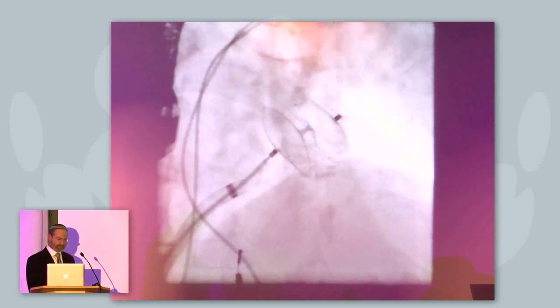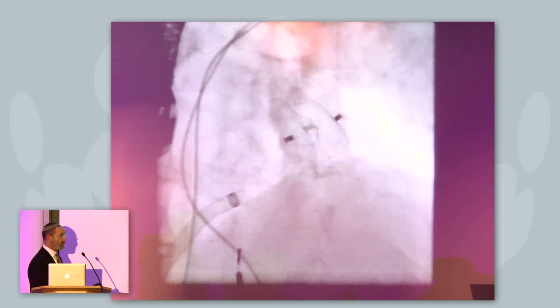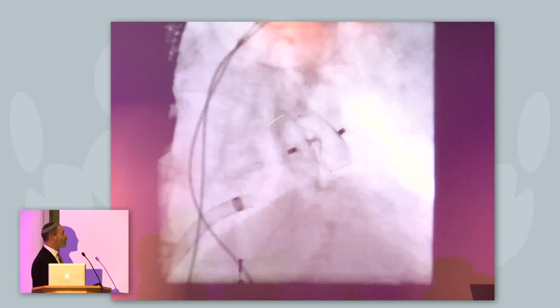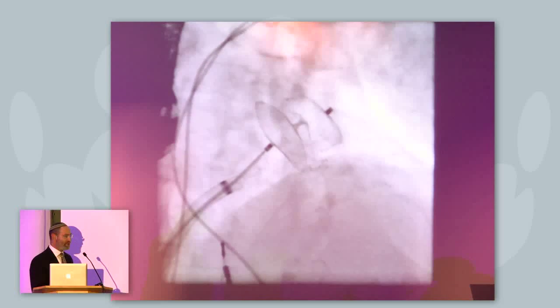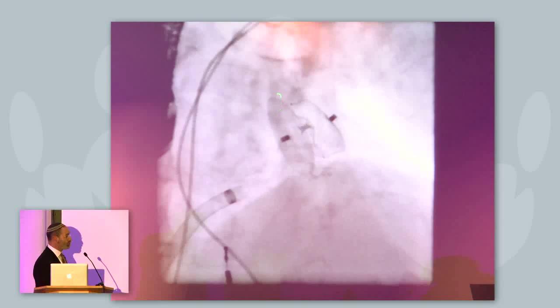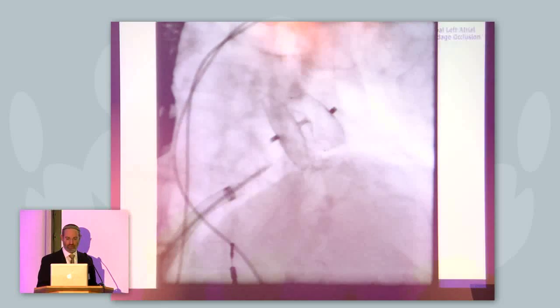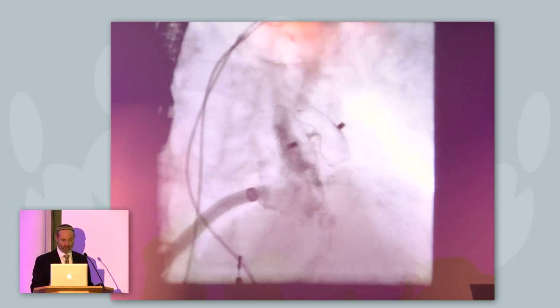And here, we've reached the point of device release. Device release is with a bit of tension. You need to keep a little bit of tension on this disc as you're releasing it because it tends to push forward if you don't. So you may actually push the disc forward behind the ridge, so keep a little bit of tension when you let it go. Each one of these steps will prevent those complications that you want to avoid.